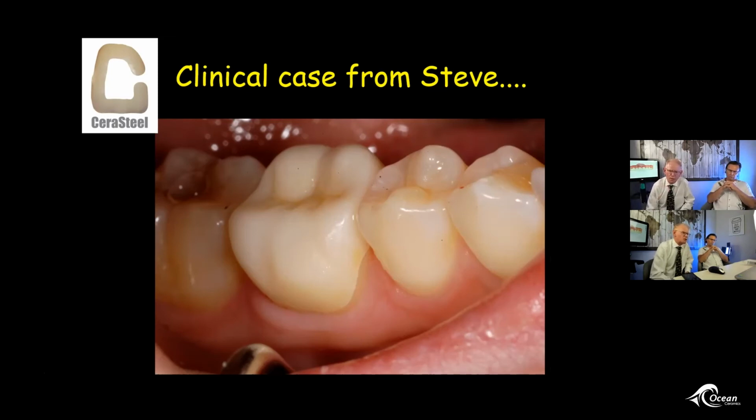Now, trivia question, what's wrong with his crown? Docs? And whose fault is it? It's my fault. No. Any takers? Anyone? Everybody's afraid. Okay, so where's the cusp of Carabelli on this one? Values too high. James' fault. It's your monitor.